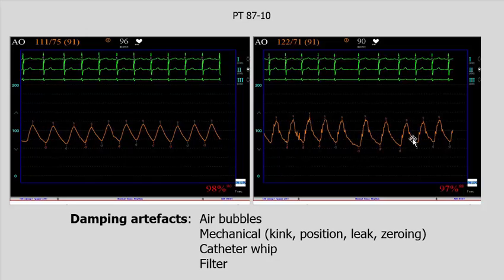So these are the little clues that tell you whether it's a good pressure trace. You can make out your little markers, physiological markers like that. You can make out systole and diastole quite easily, and it's a good looking trace. This is a sad looking trace. That's because there was an air bubble in the line.